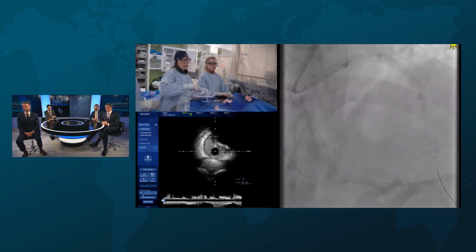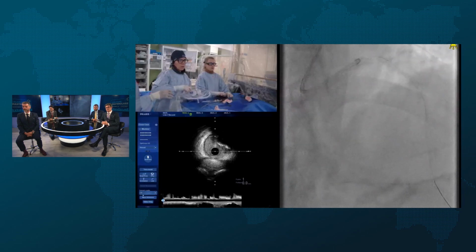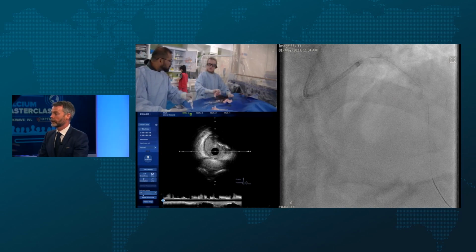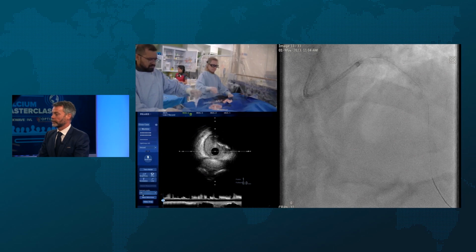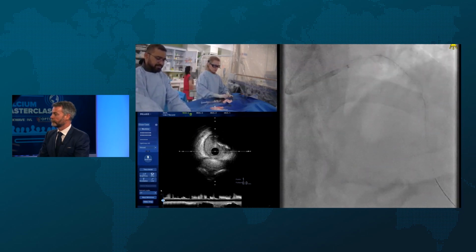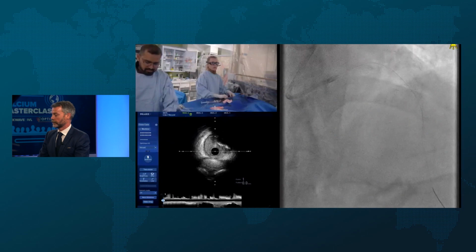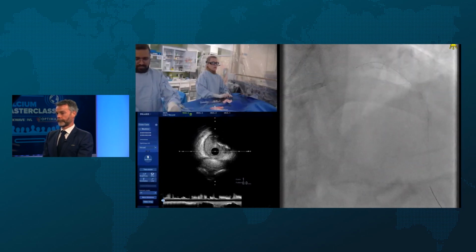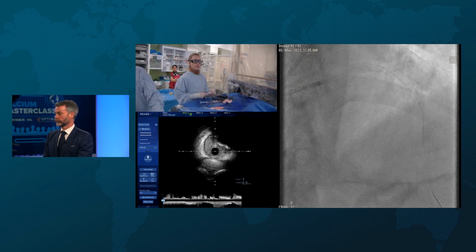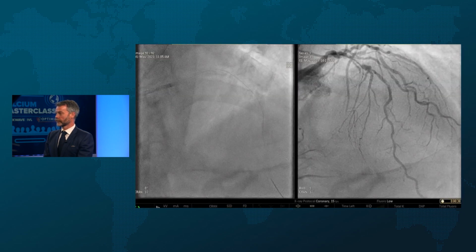So what's the EEL in the proximal LAD? You're going left main, I presume, here, are you? I think it's 4.5, isn't it? Proximal LAD. Just talk us through that IVUS, Margaret, maybe while Claudia is working, just to show us the learning points for the audience and where you're going to go in terms of stent sizing, etc. Okay. So you get IVUS full screen. Is that possible? Yeah, it should be possible. Even if you can't go full screen, we can see it well.